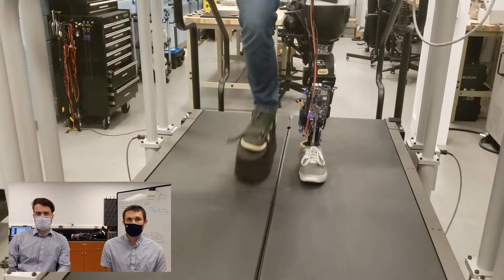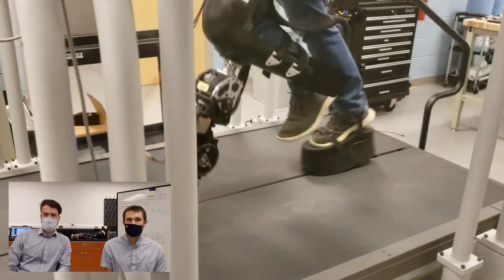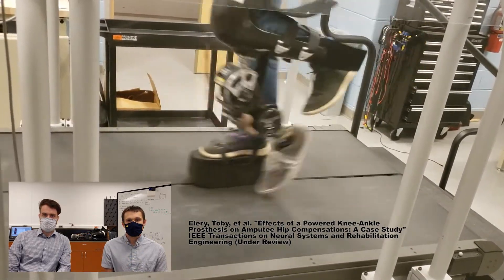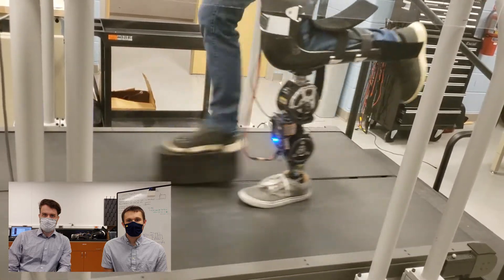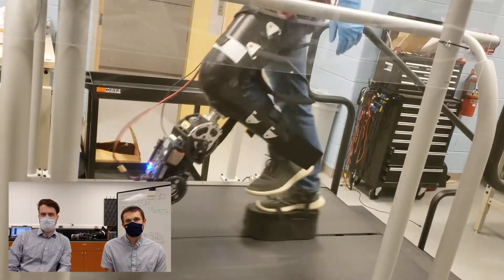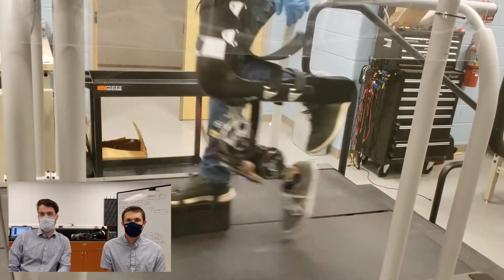However, this highlights one of the benefits of this controller — its intuitive user control interface allowed me to acclimate to using the device with minimal training time. This video shows Kevin using our holonomic phase-based controller to walk at 1.2 meters per second. You may notice that he occasionally leaves the prosthesis suspended in late swing before heel strike. It does show that our controller is capable of accommodating asynchronous gait actions like this, which could not be possible on a purely time-based controller.